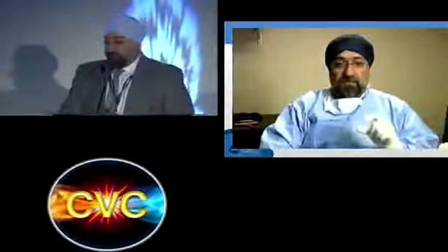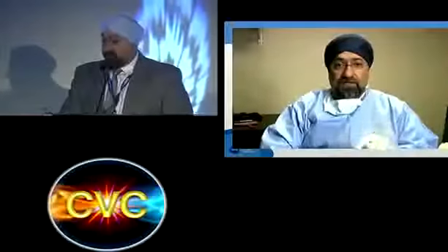Some folks like to just sclerose that with foam, but I don't like to do that because the foam goes into the deep system. So we'll do an ablation of that segment just at the fascia, which we'll look at on the ultrasound in a minute.